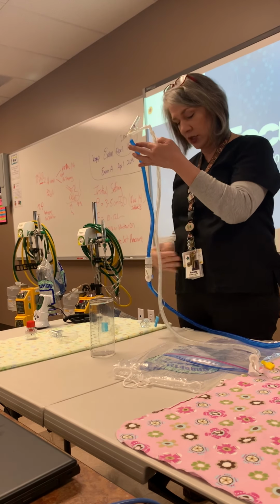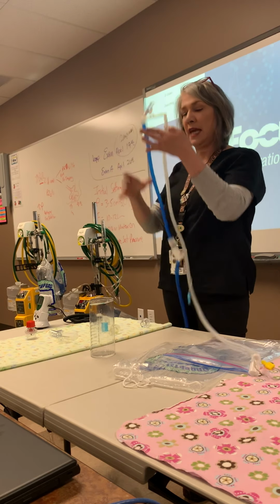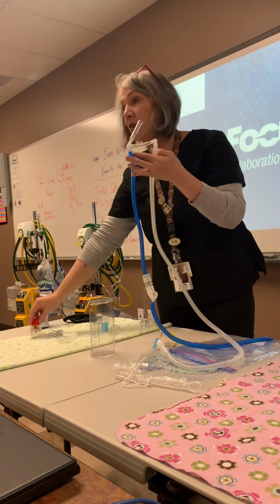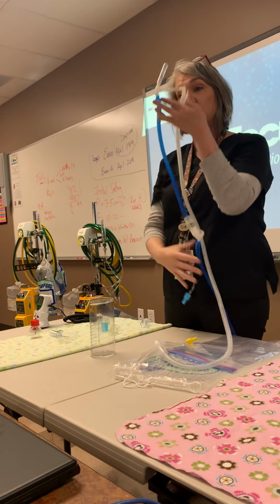If there's a pressure change in my system, kinked tubing, somebody bumps it, whatever the case, I don't want baby to automatically get that pressure. Now, with the pop off, it should kick it off, but this is also going to tell you where your pressures are. So that's why it's close.